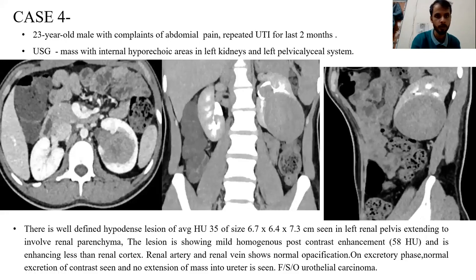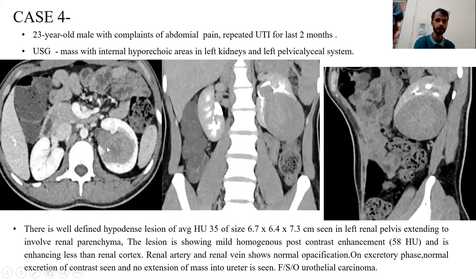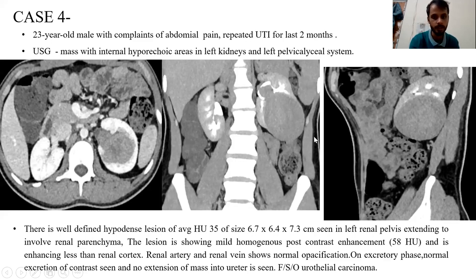Case 4: A 23-year-old male with complaints of abdominal pain and repeated UTIs for the last two months. Ultrasound showed a mass with internal hyperechoic areas in the left kidney and left collecting system. On axial, coronal, and sagittal CT abdomen images, there is a mass in the region of the renal parenchyma extending into the pelvis. The mass is less enhancing than the renal parenchyma but still enhances by more than 20 HU. The collecting system is opacifying, and the ureters can be seen. There is no invasion of the ureters or adjacent vascular structures. This is a case of urothelial carcinoma.